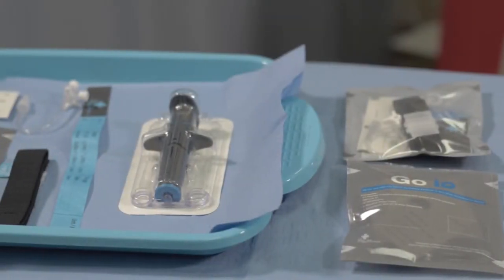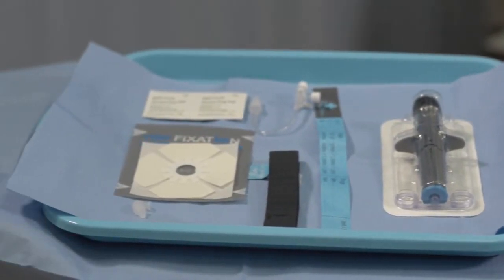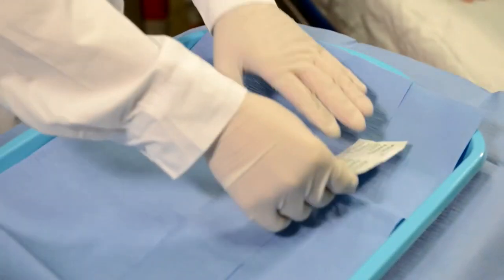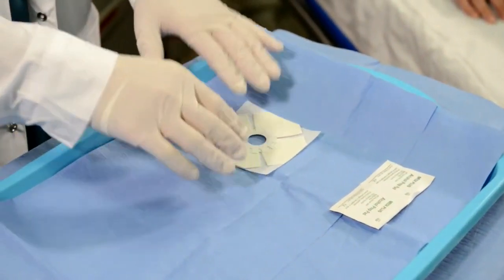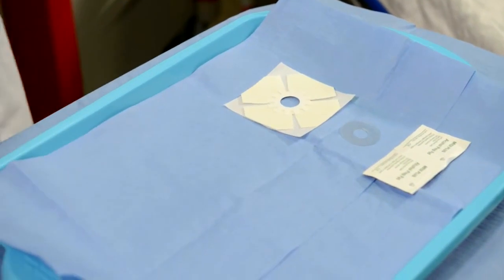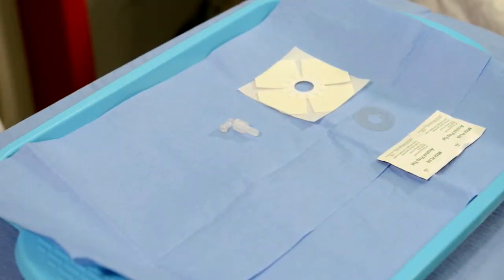The GO-IO has all the essentials for fast, safe and easy intra-osseous access. Alcohol prep pads. The NEO fixation sticker. Adapter for use with drill-based I.O. devices. 90-degree lure lock connector for standard I.O. and I.V. lines.